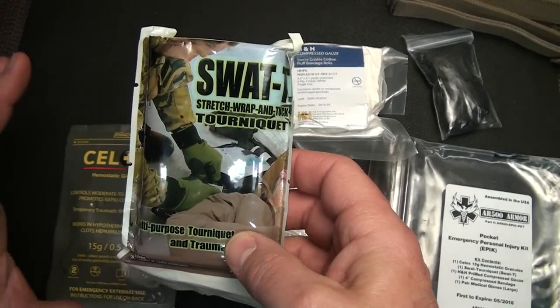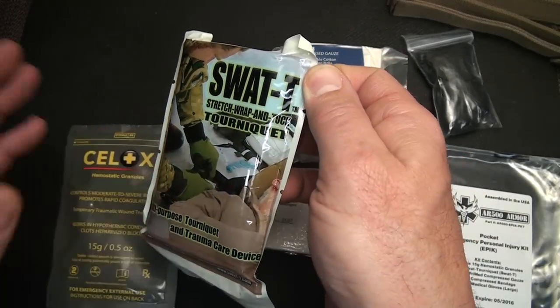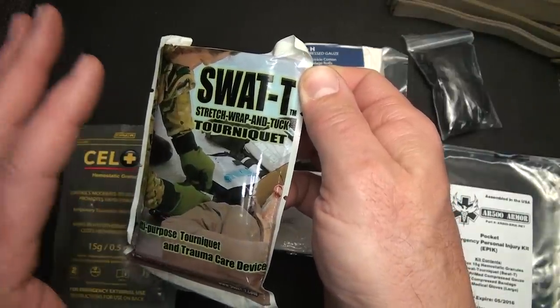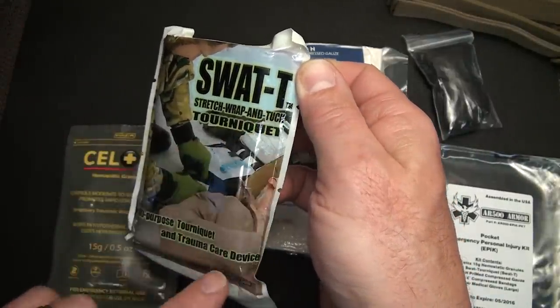Now, one of the things that I really like about this system is the SWAT-T. And this is a stretch, wrap, and tuck tourniquet. So that's where SWAT comes from. Stretch, wrap, and tuck. And then the T is for tourniquet. Now, the SWAT-T tourniquet is really a unique item. So I really wanted to demonstrate how you can use this. And really, there are so many different uses for this item.